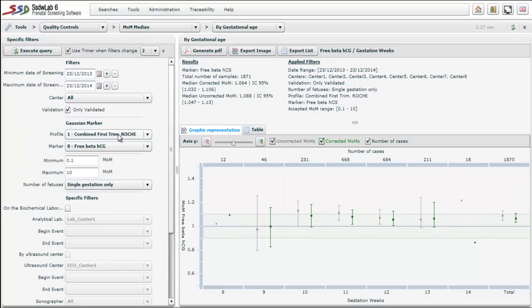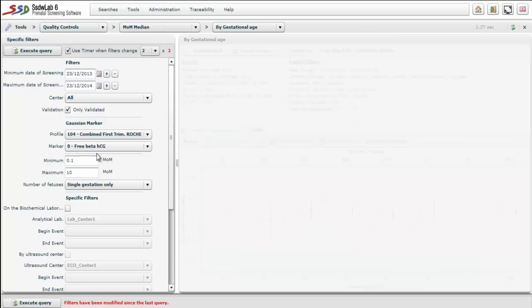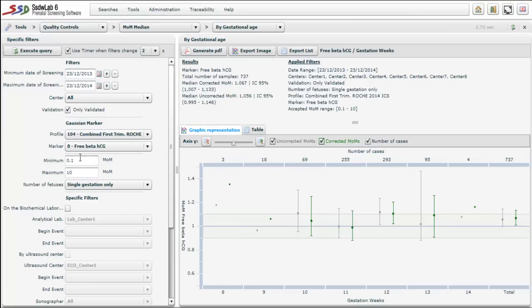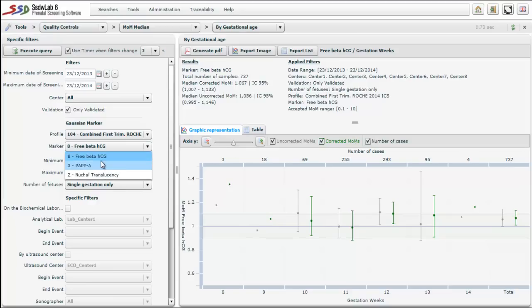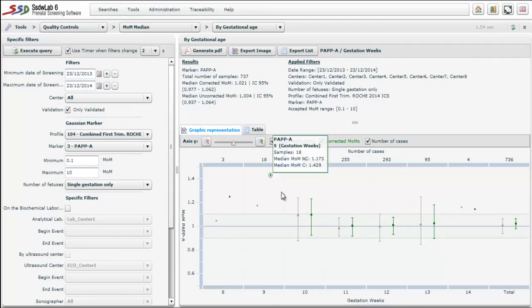We define our selection — for example all cases, validated or not — the profile we will take data from, in this case a first trimester combined screening profile. We also select the marker, such as chorionic gonadotropin, and choose single fetus. We click Execute Query and automatically the median of multiples of the median by gestational ages is presented. The median corrected MoM is 1.067 and the uncorrected median MoM is 1.056. If we execute the query for PAPP-A, we see that both median MoM values, corrected and uncorrected, are inside the limits for each gestational week.